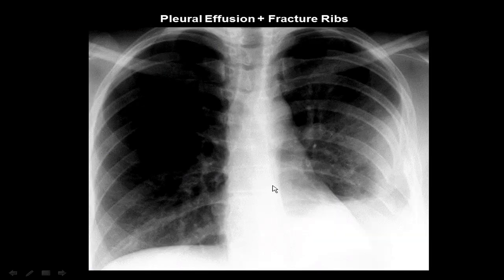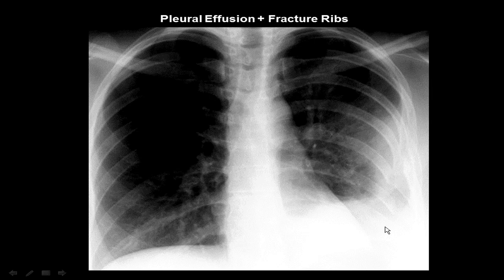This chest X-ray posterior-anterior view shows multiple fractured ribs at multiple sites. We have to also detect any bone abnormality on the chest X-ray — we have the ribs, the scapula, the clavicles, and the vertebrae. Here are the multiple fractured ribs with obliteration of the left costophrenic angle, with rising fluid towards the axilla. It's fractured ribs with pleural effusion.